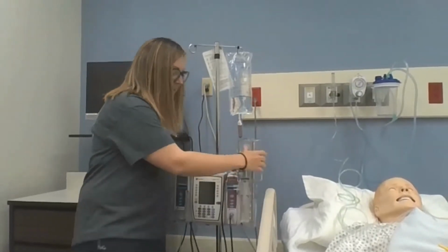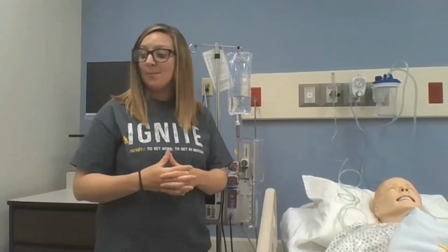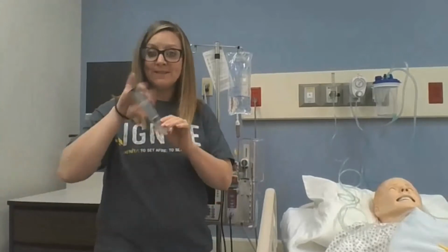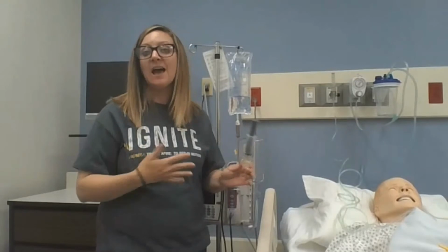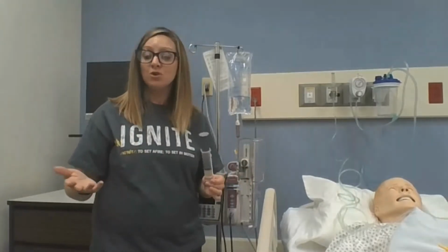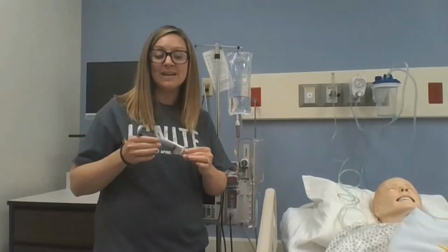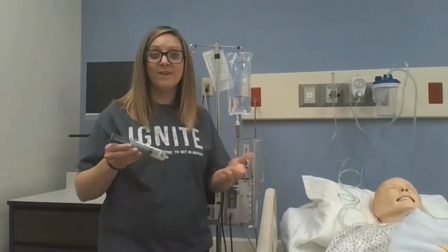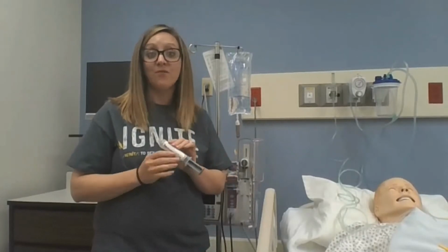Where do you get your medication on a PCA? If you've got a PCA ordered, you are going to get your PCA drug out of your Omnicell in some circumstances. It kind of depends on your unit. Post-surgical gives a whole lot of narcotics. So they are going to have these loaded in most cases in their Omnicell if it's morphine or something like that. If it's Dilaudid, oftentimes they're going to have to get it from pharmacy.